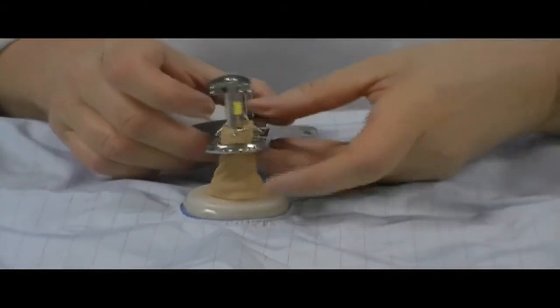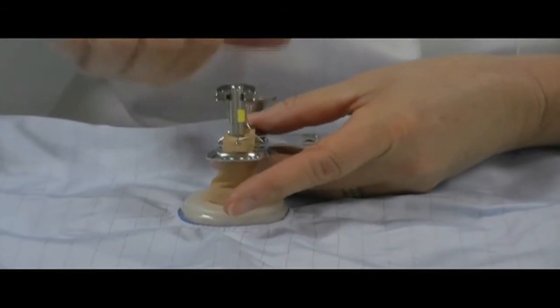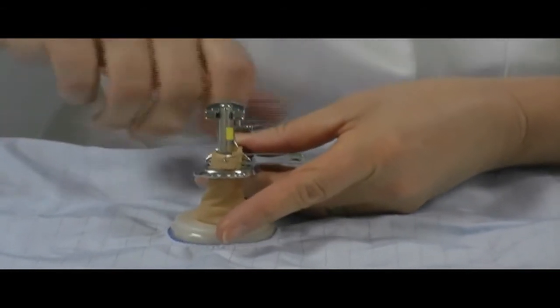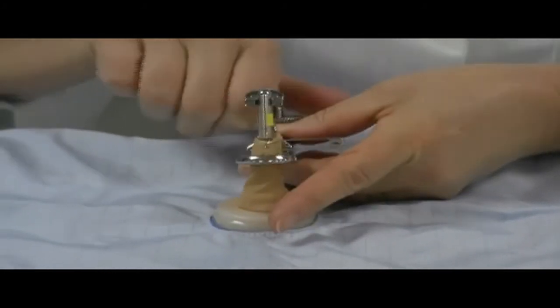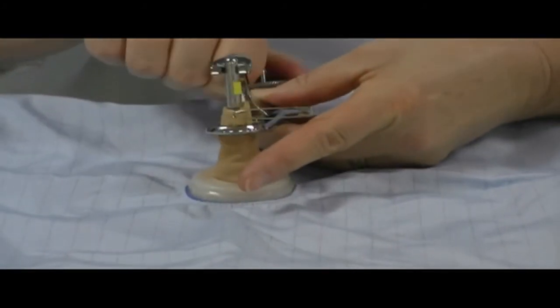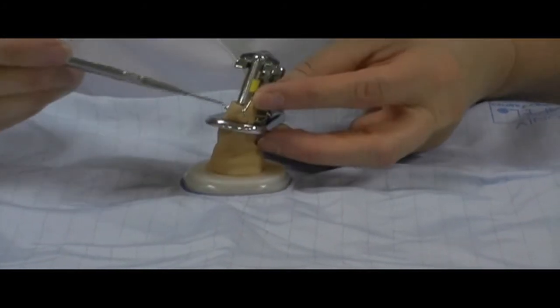Place the clamp onto the simulated penis, clamp it down, and then you will just use a scalpel just as you would using the Mogan clamp to cut the excess foreskin away.